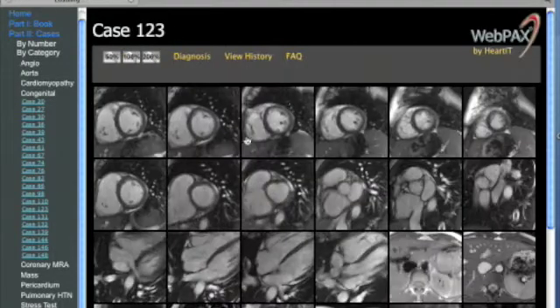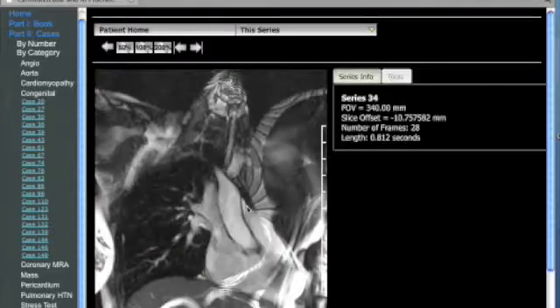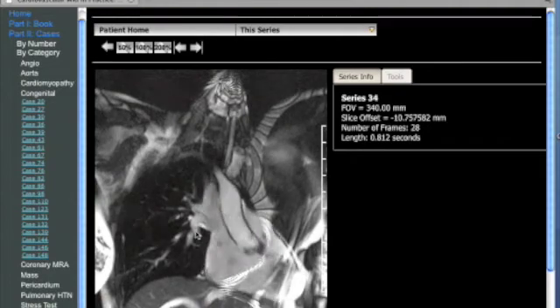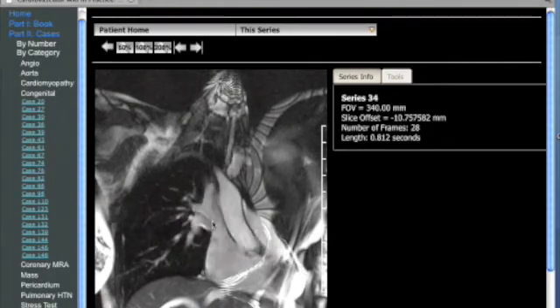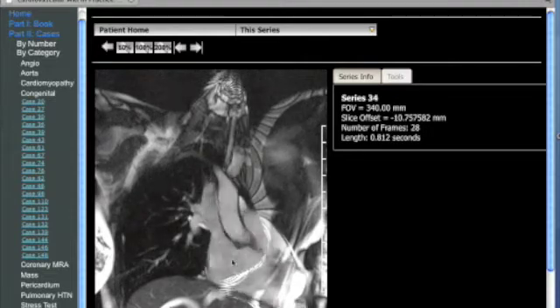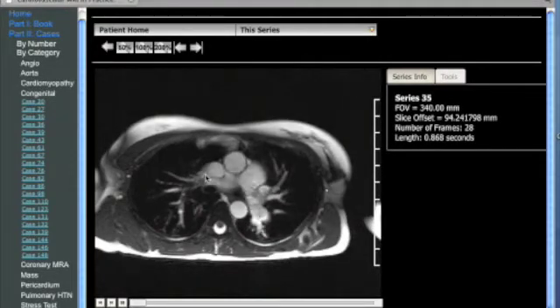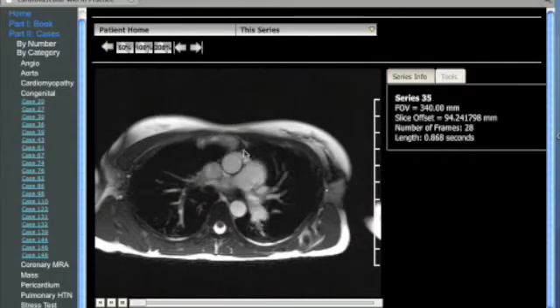The next image was obtained in the coronal plane, in the plane of that abnormal vein that was seen, and demonstrates that the right upper and right middle lobe pulmonary veins are seen to join the superior vena cava and drain into the right atrium, producing significant enlargement. This axial cine imaging confirms again the blood flow streaming from the pulmonary vein into the superior vena cava.